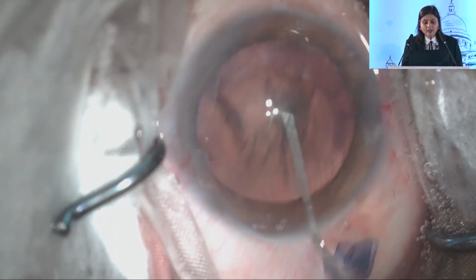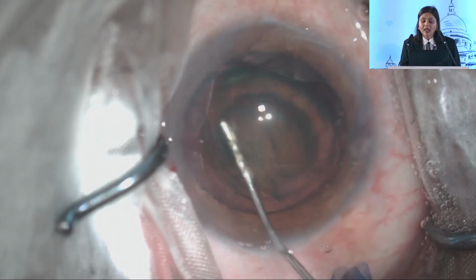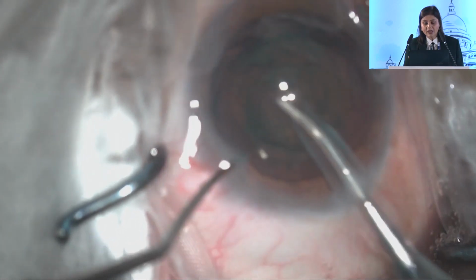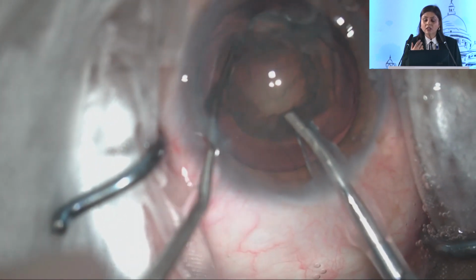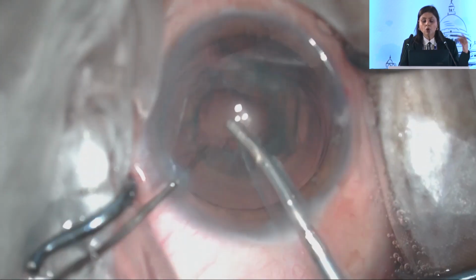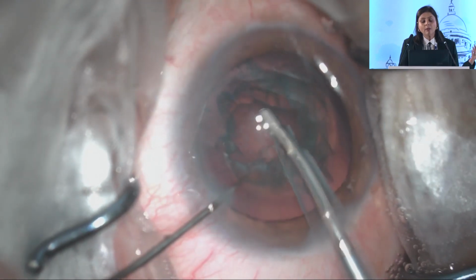Again, I have a decent sized rhexis. So what I'm going to do is prolapse one of the poles slightly, but this patient has a small central nucleus as well. So a good hydrodissection and then a good hydrodelineation, followed by removal of this anterior epinucleus which sticks to the nucleus, gives us access to this small endonucleus. Then we have just used the chopper to nudge this endonucleus up and emulsify it with ease.